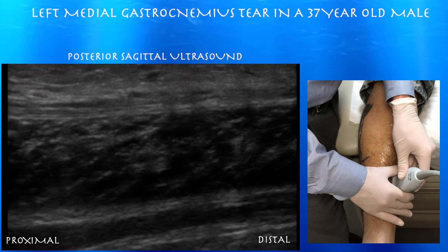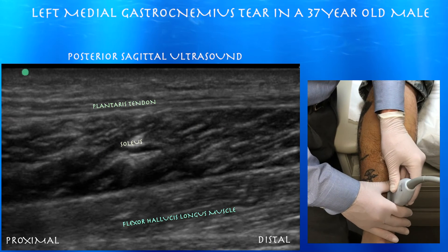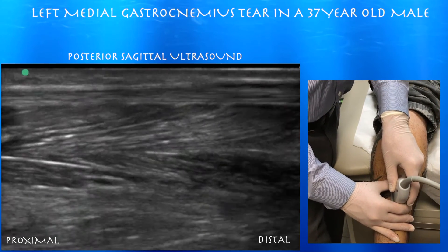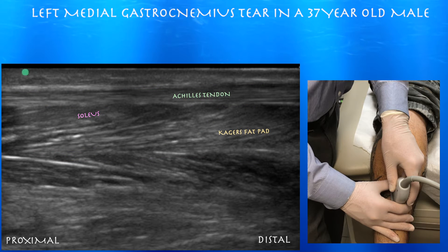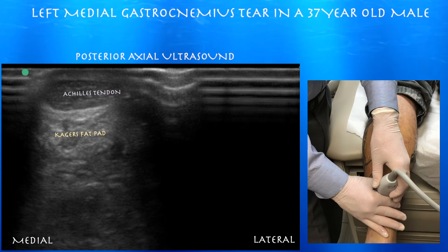Here's the thin plantaris tendon that starts laterally at the lateral aspect of the knee and then goes medially. You can appreciate the muscle layers — you've got the plantaris underneath, then the soleus, and the flexor hallucis longus muscle. Here's the Achilles tendon following that up, which looks okay and normal.